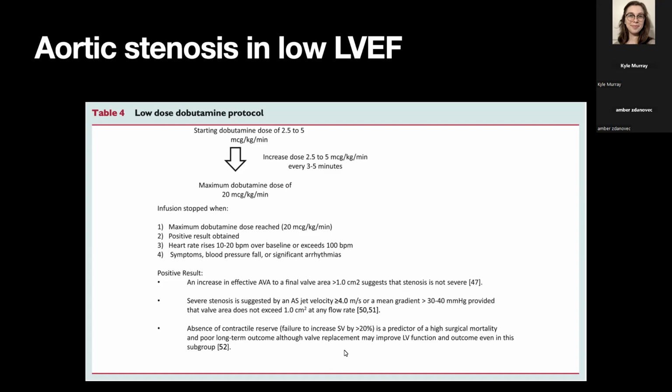Have you ever seen it where you have pseudostenosis, but the valve is actually totally normal, or is it usually like moderate stenosis? I don't know. We don't see a lot of dobutamine stress. We're scared. You can get into a bunch of more difficult scenarios in this, but I didn't deep dive into them. The guidelines do show more difficult scenarios that you will need to know, but not for this.